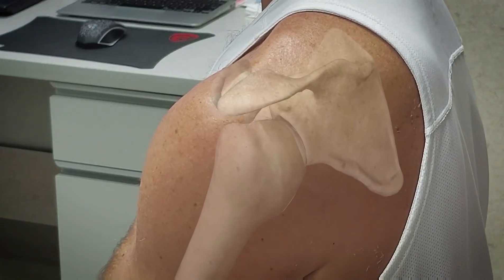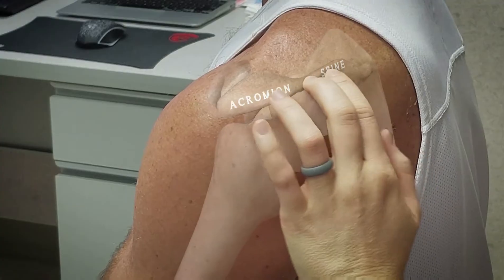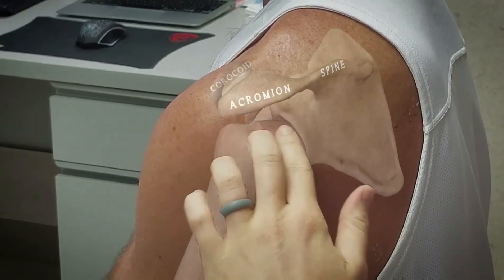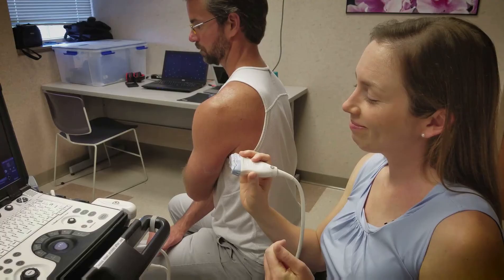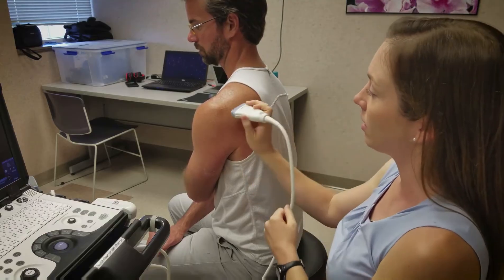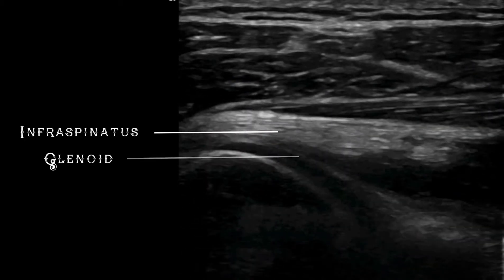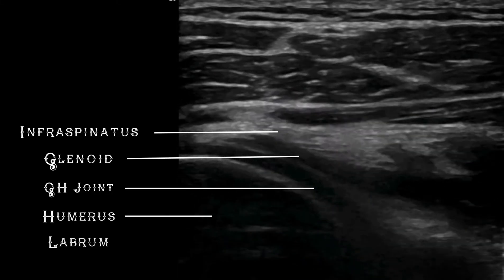Three bony landmarks might be helpful for this procedure: the acromion, the spine of the scapula, and the coracoid process anteriorly. The probe should be placed in the transverse plane just inferior to the acromion and parallel to the spine of the scapula. Apply the probe with the transducer indicator in the lateral position. The landmarks to identify on the ultrasound are the infraspinatus muscle, the glenoid, the humerus, the glenohumeral joint space, and the glenoid labrum.